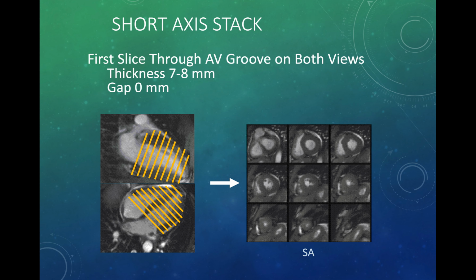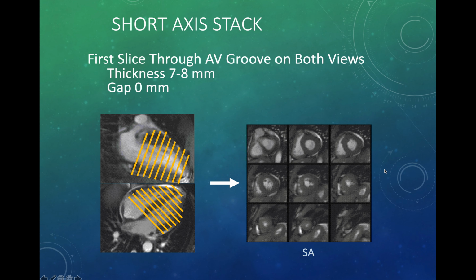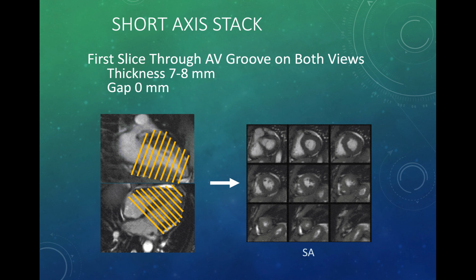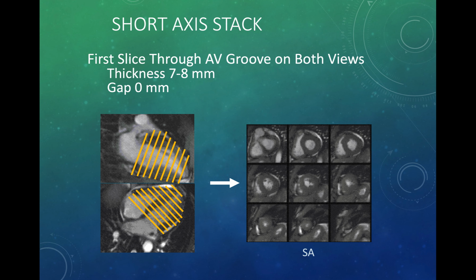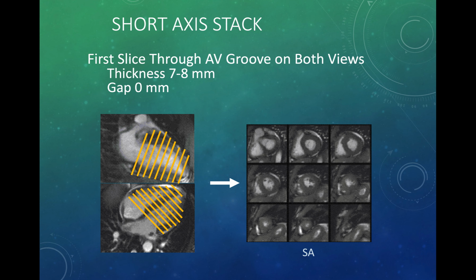whether there is hypertrophy or no hypertrophy. A septum above 12 millimeters, we will call a prominent septum, in the direction of hypertrophy, and then we could grade the hypertrophy as mild, moderate, or severe. Also, we could grade it as symmetrical or asymmetrical, because certain pathologies like systemic hypertension and aortic stenosis cause symmetrical and concentric hypertrophy, while other pathologies, for example HCM, cause asymmetrical hypertrophy, more evident in the basal septum.